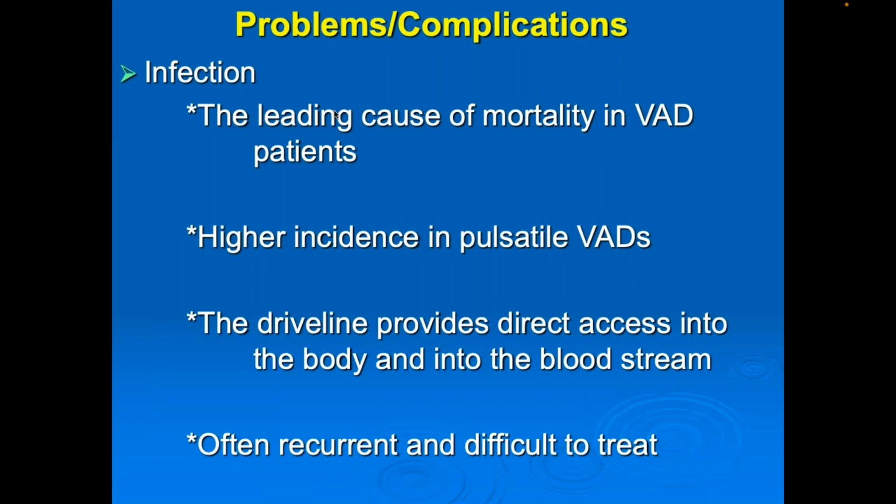Infection is a leading cause of mortality in VAD patients. There is a higher incidence in pulsatile VADs, and the driveline provides direct access into the body and into the bloodstream, often recurrent and difficult to treat. You need to check for signs of sepsis.